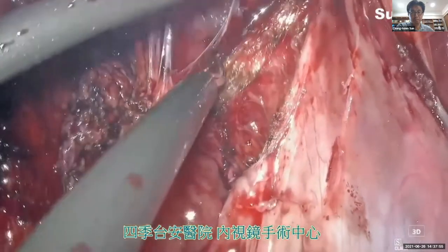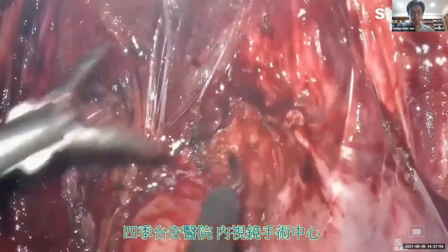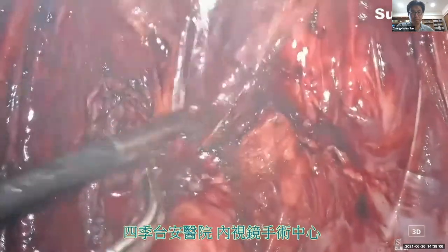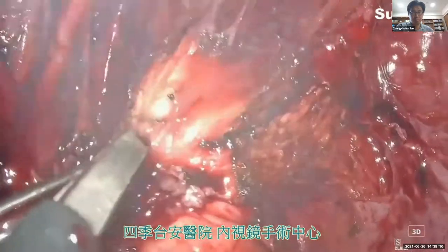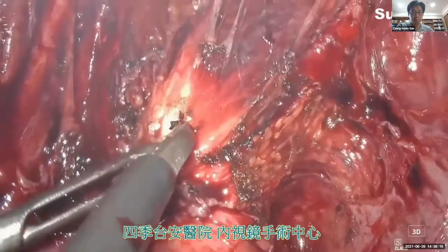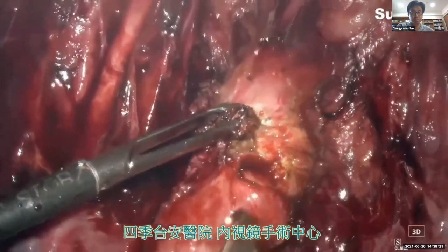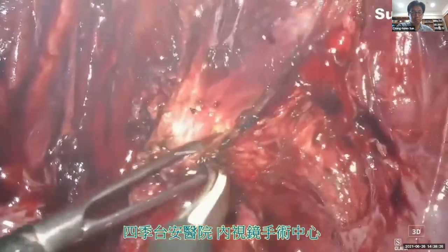There are three ways to remove the rectal DIE lesions. The first is shaving, the second is disc excision, and the third one is segmental resection and anastomosis. Today we are going to perform a shaving technique. The first step is to remove the perirectal fat. I am continuously using my instrument to palpate to feel the margin of the DIE nodule.